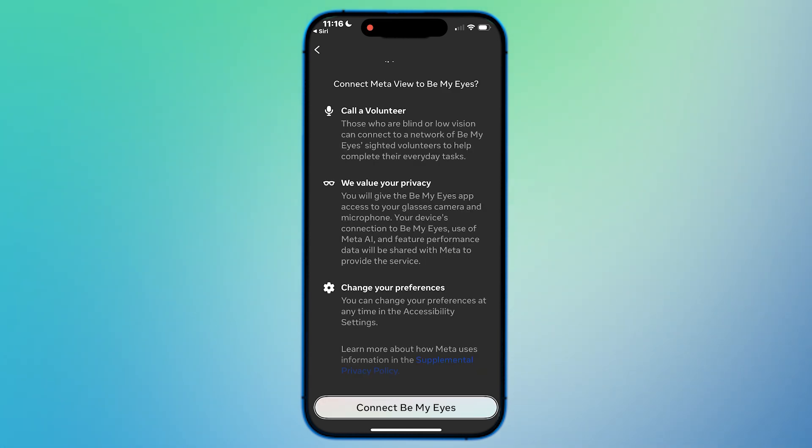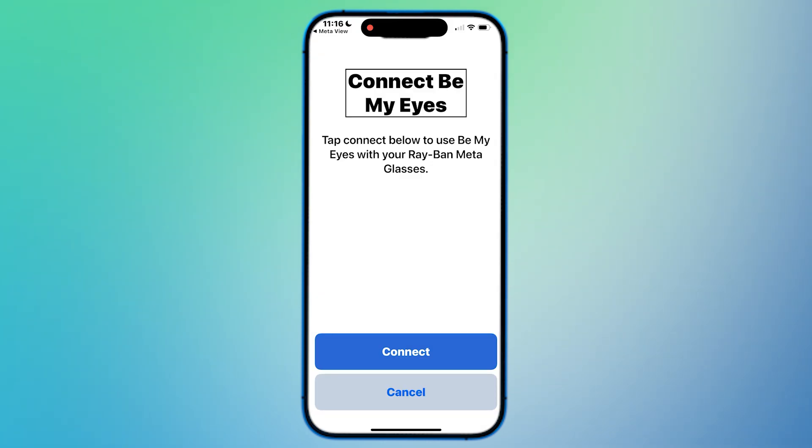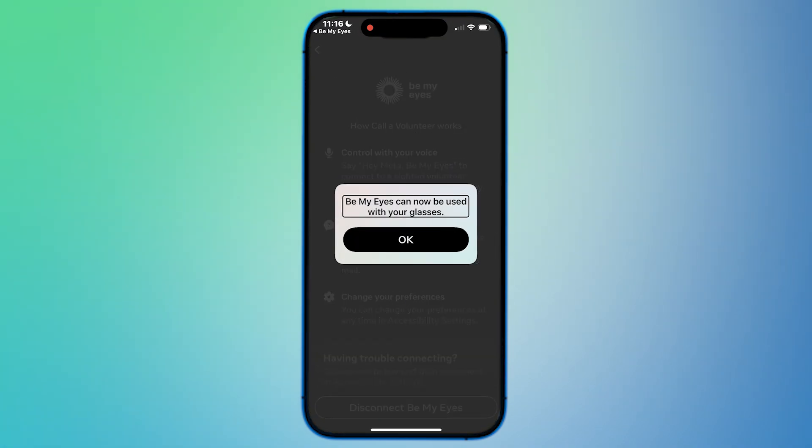There we go — Connect. We'll tap on Connect again, and it tells us Be My Eyes can now be used with our glasses. We'll tap OK. So we've now connected our Meta Glasses to Be My Eyes. If you ever want to disconnect, just follow the same steps: go to Settings, Accessibility, and under Be My Eyes you'll see an option to disconnect versus connect.